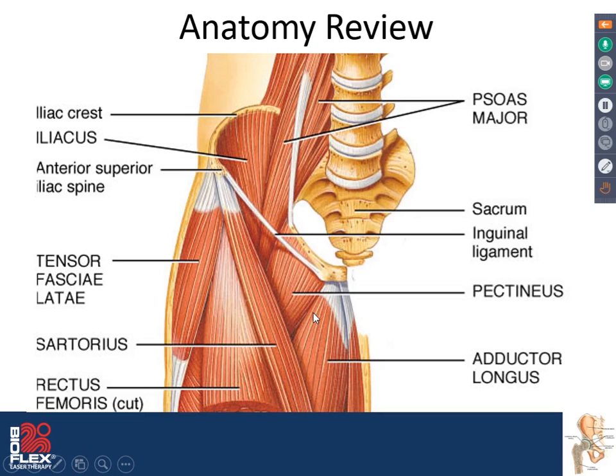And when we're talking about hip joint disorders and laser therapy, this is probably one of the most challenging joints to treat because of the depth of the joint and the number of muscles that create a barrier for light to enter directly into the hip joint. That being said, there's actually very little research on hip joint and laser therapy. And again, the reason for that is it tends not to respond as easily as other areas that you can get light to. So I'm going to talk about this as we go along.